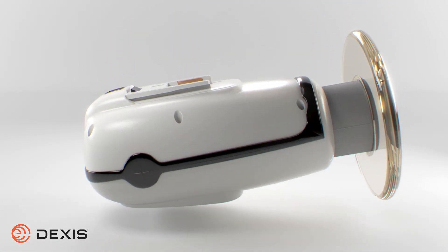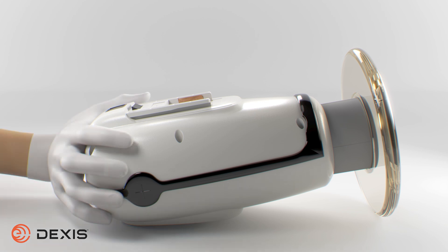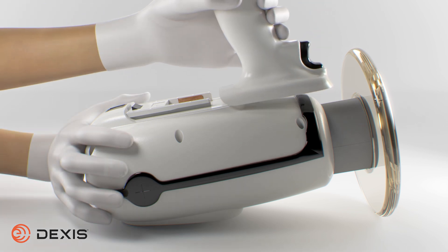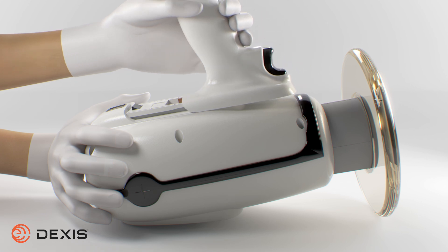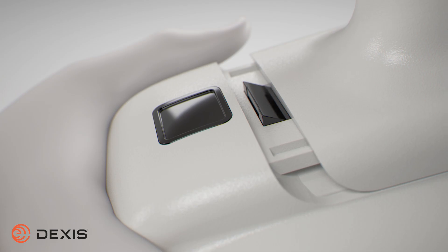To attach the handset to the Nomad, place the face panel down on a solid surface. Support the Nomad with one hand. With the other hand, align and carefully slide the charged handset onto the base of the Nomad. The handset should click into place with firm pressure.